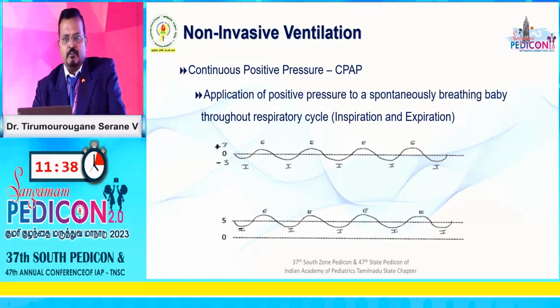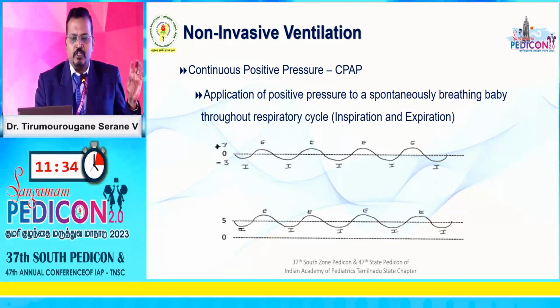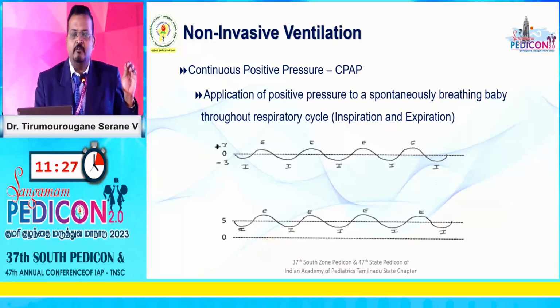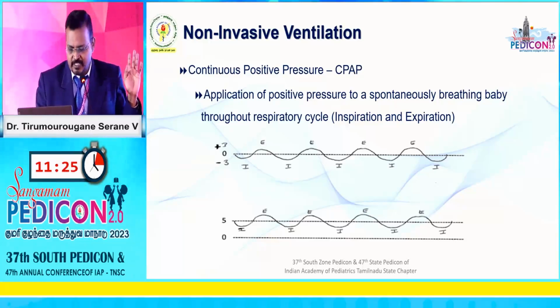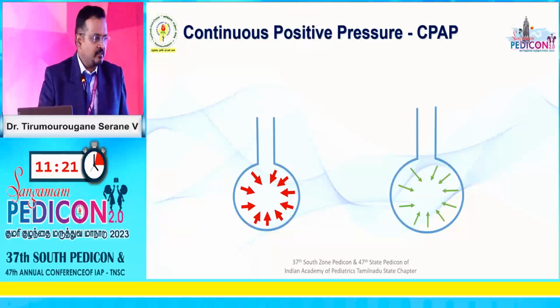So what is CPAP? What are the various modes actually? Whatever NIV modes we talk about, the basic idea is that you apply a constant positive pressure for a baby who is breathing, both during inspiration and expiration. That's what it means. Now, let us see what happens.